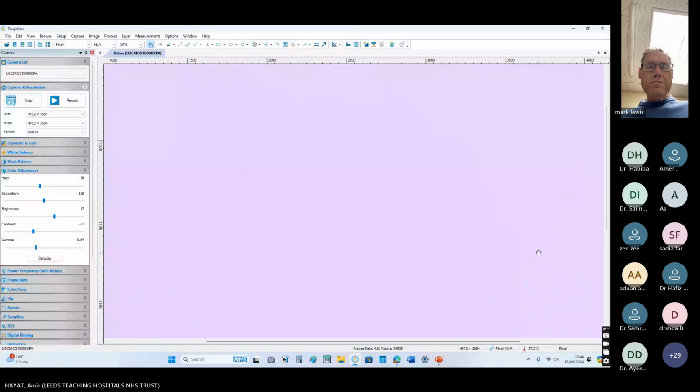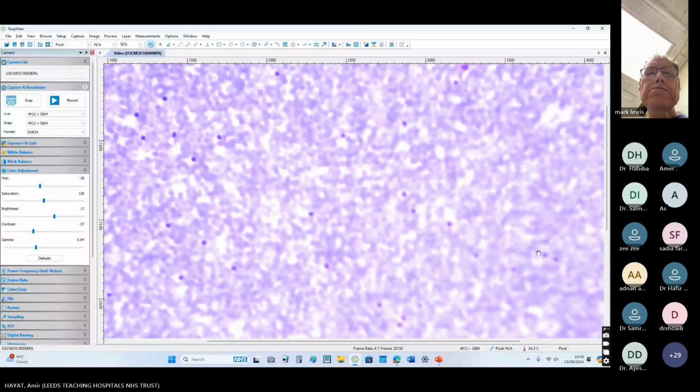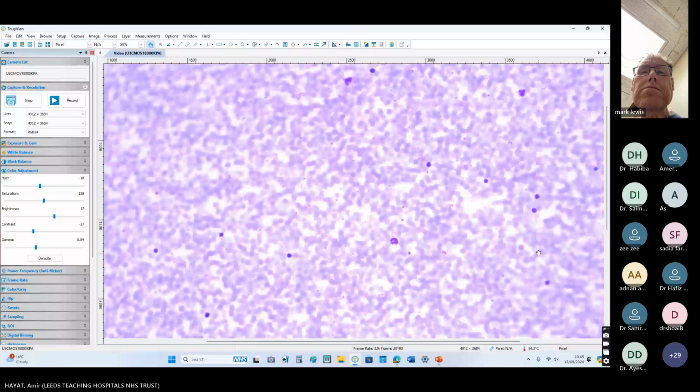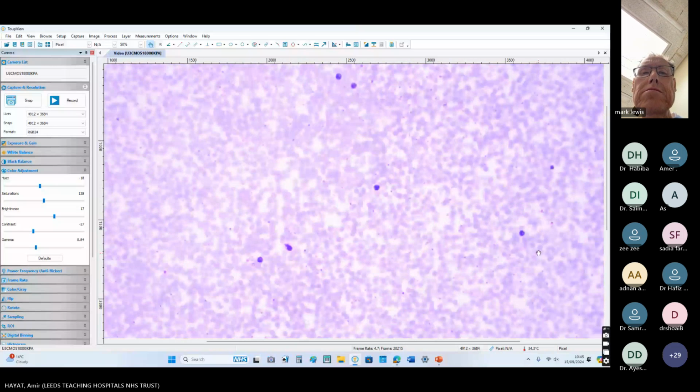So the last question is from parasites. This patient has just returned from Argentina and is now complaining of difficulty swallowing. Right, so this is the power 10.